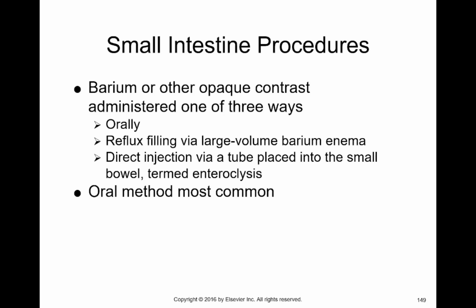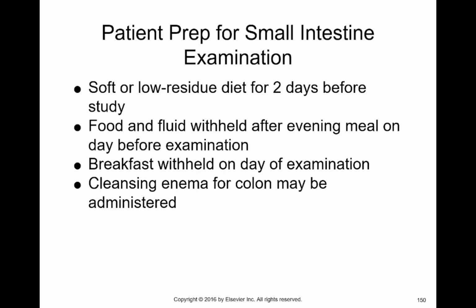I've never seen that procedure intentionally done. I have seen failure of the ileocecal valve. We were doing a Gastrografin enema on a patient, where it got to the ileocecal valve and completely filled the colon up, and the ileocecal valve was wide open, and the contrast went all the way back up, all the way through the stomach and into the esophagus. So it can be done reflux, but I've just never seen it done intentionally, just that one time entirely on accident.